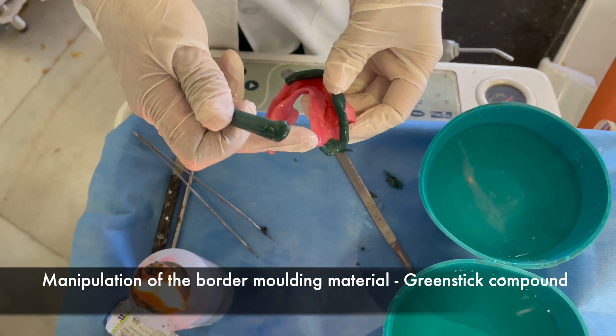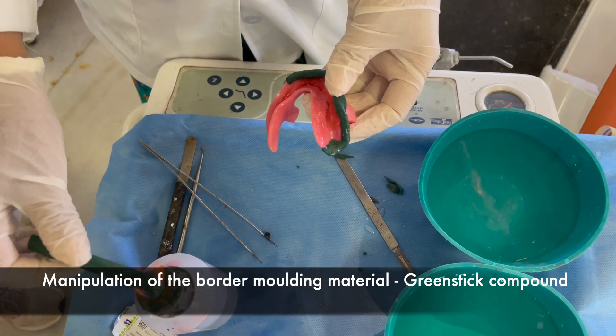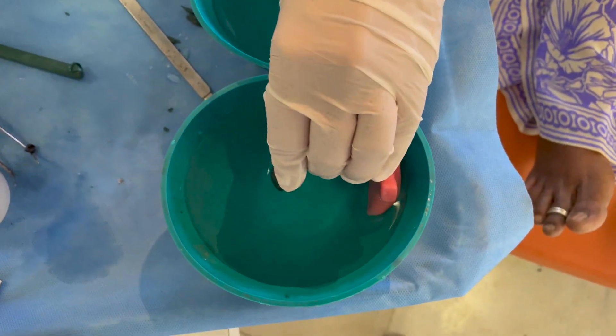The green stick compound is softened over a flame until it begins to droop. It is placed on the borders of the custom tray, rotated slightly and pulled away. The material is then tempered in warm water, formed into an appropriate shape, and inserted in the patient's mouth.